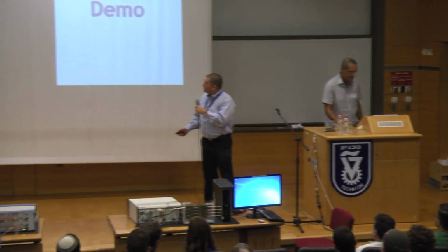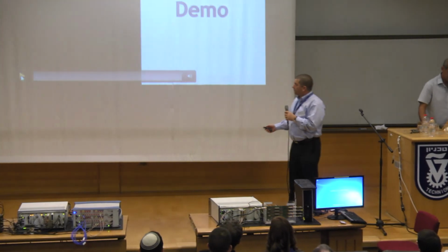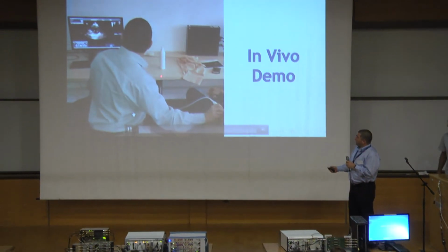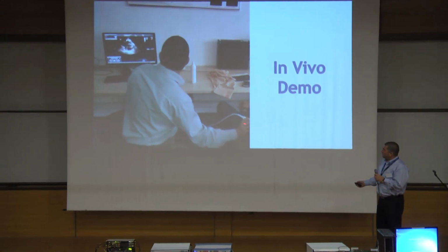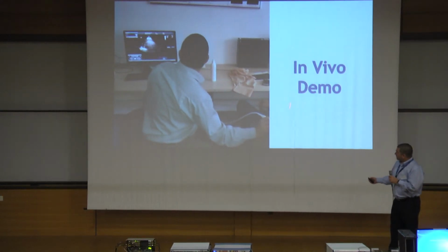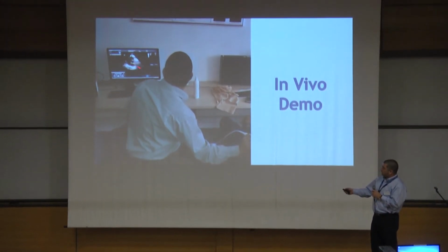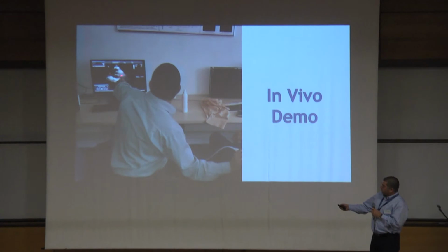I have a strong voice, but hello everybody. Thank you very much for being here. So actually, this is the first time we tried it on a person who is right here, and what we can see here is actually the heart itself. You can see it beating as we talk.